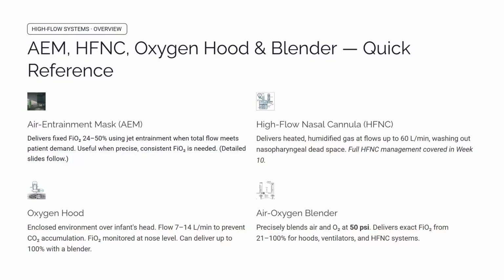The awake, stable patient needing a small amount of oxygen, we use the nasal cannula, low flow, variable, and that's fine because their demand is modest and steady. But that severely hypoxic patient working harder to breathe, they need a reservoir system because a small device simply can't keep pace with how much air they're pulling in.